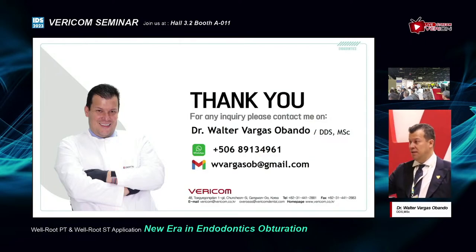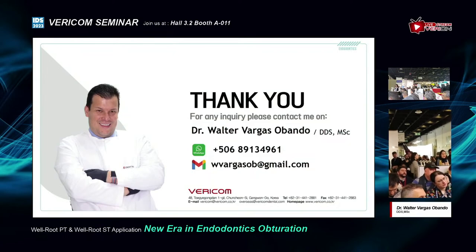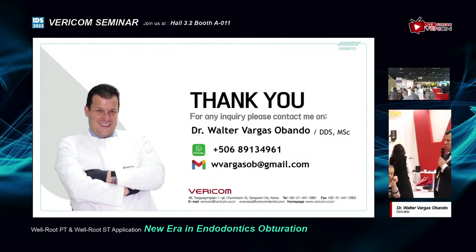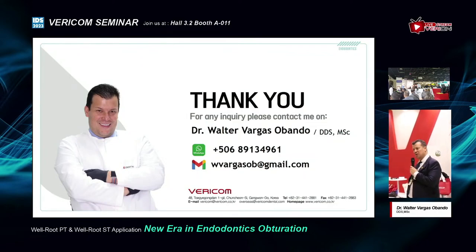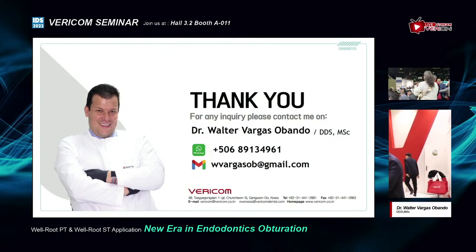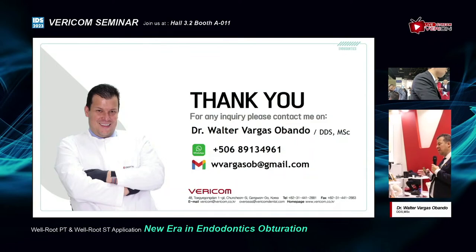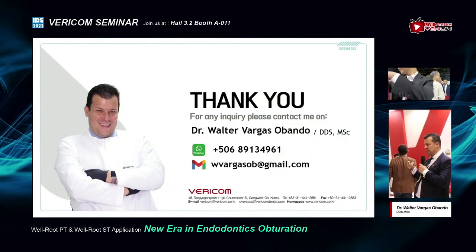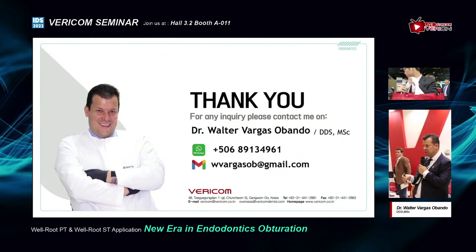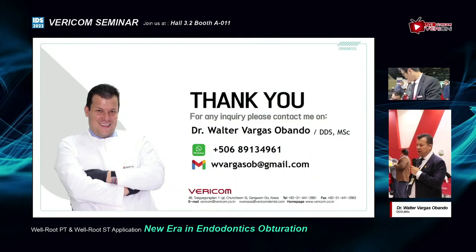Yeah, please. What's the optimum time for the calcium hydroxide before the final set? And do you do any lateral condensation? Okay. Most of the time, I don't do lateral condensation. I only push the part of the gutta percha over the floor chamber with the hand plugger, and that's it. And what was the other question about? Okay, I really like 8 days. It could be 2 weeks, 15 days, but the effect from the calcium hydroxide will decrease really fast after 8 days. So I prefer 8 days.